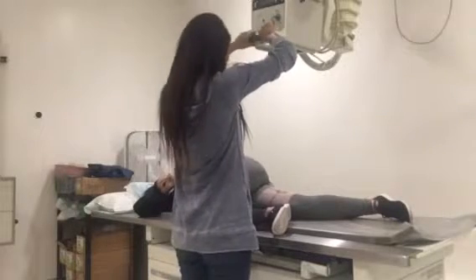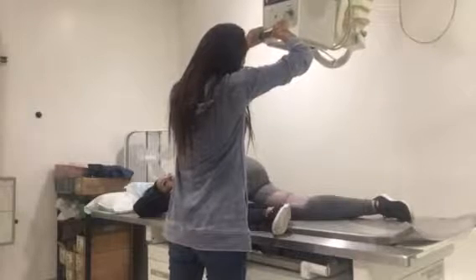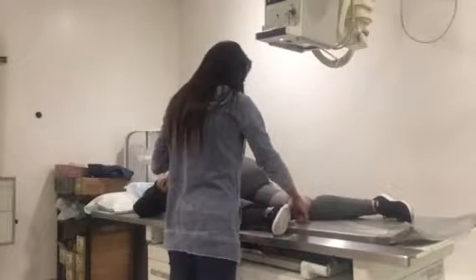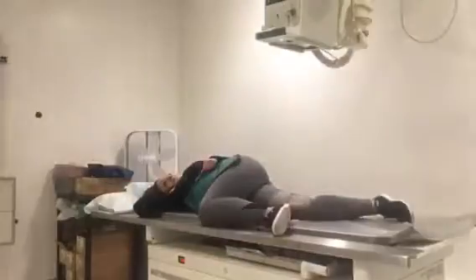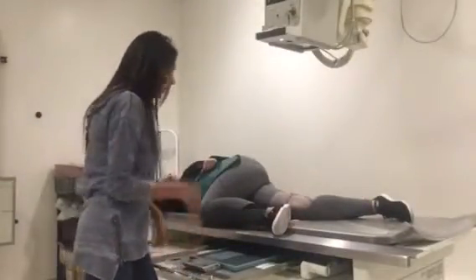And my central ray will come in at the epicondyle. So I put a new IR in, so then I'm going to do the exposure. X-ray. And then I would read my IR.